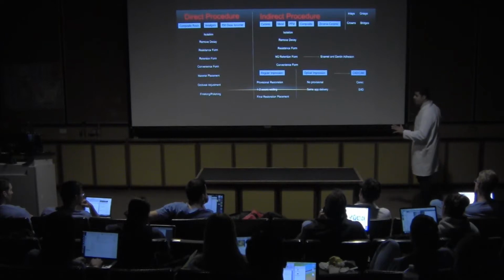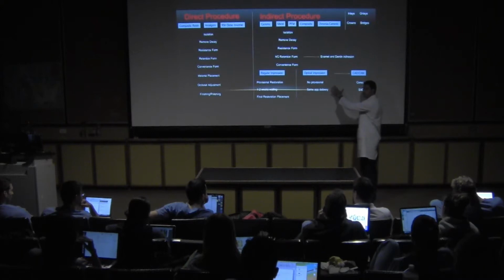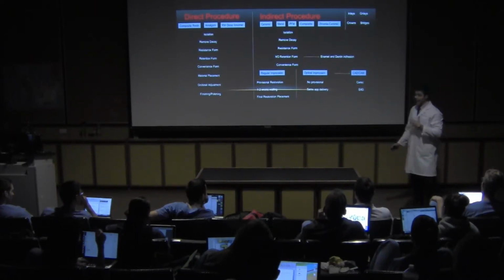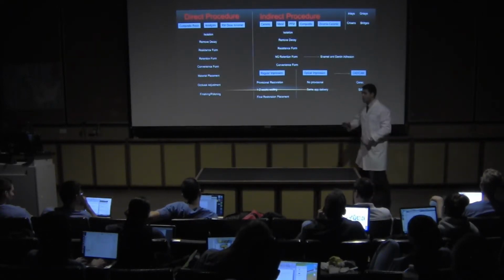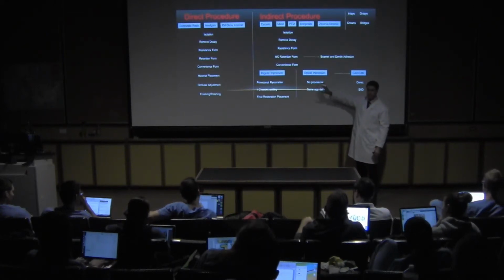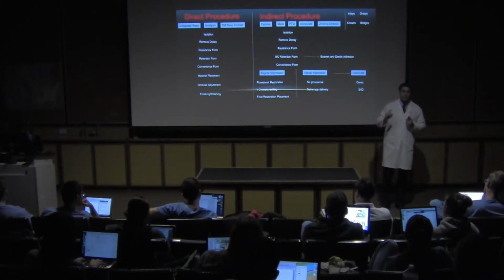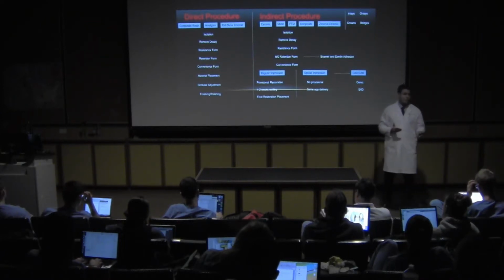If I have available optical impression, it's a little bit different. On the same appointment, I'm going to do the optical impression, and I don't need to do provisionals because I'm the dentist, or if you have an assistant, will work on the creation of this restoration on the computer screen, and then I will send the digital file to the milling machine, and after 10 to 15 minutes we will have the restoration ready to be cemented.